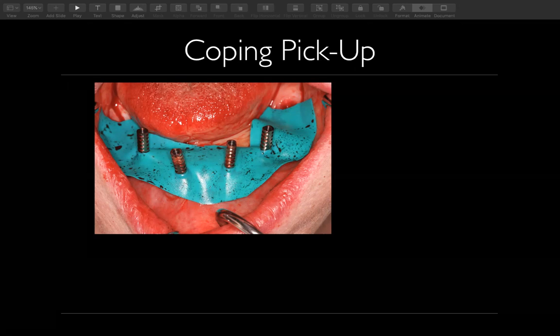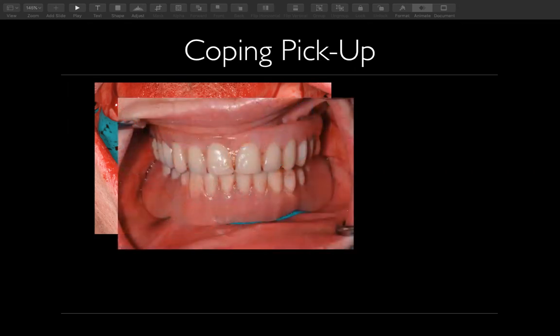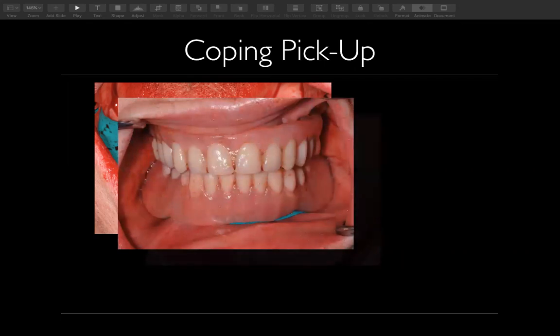Again, we're relining this denture. This denture was made with just teeth extracted, but now we've had bone reduction done, so we need to fill that space. When you do your pickup, you're relining and picking these up at the same time. So we don't want that material to grab on the suture. Now, has it happened? Yes. Can we get it off? Yes. Typically you have to cut it, get in there. You won't be able to get the denture out until you cut it, but it has happened. It's not the end of the world, but we try our best not to do that.